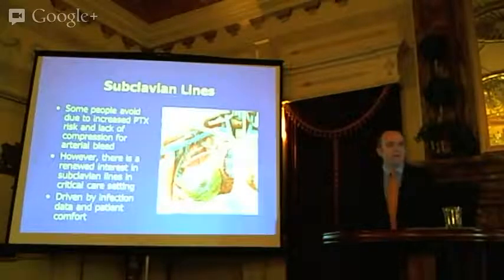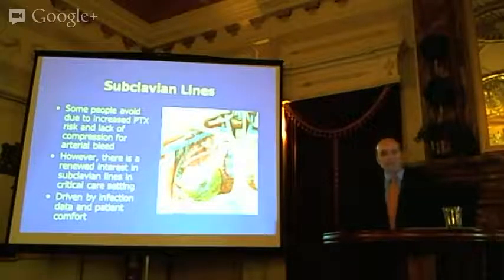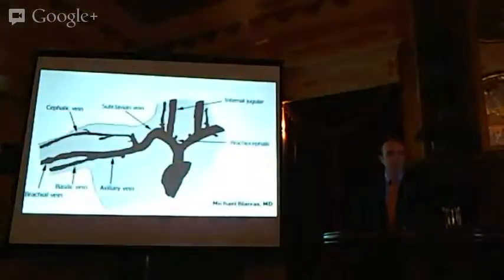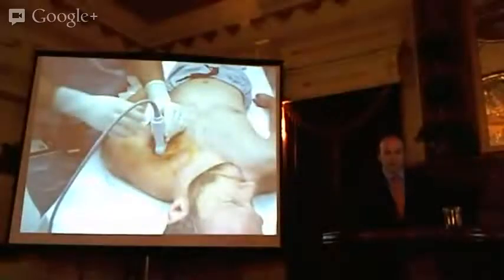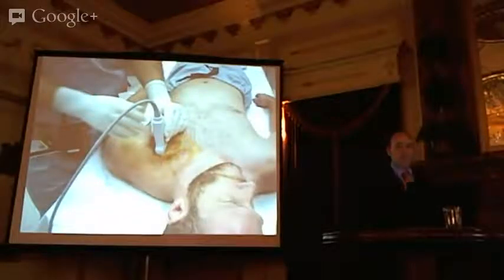Subclavian lines are also a great option. I think initially people think, subclavian, how are you going to get a transducer in that location? Well, remember, the axillary vein changes its name right about here to subclavian. It's the same vein. You can be a centimeter out from it. There's no real difference. You can still have your wire in the perfect location, and that's probably what you're really going to be doing with an axillary approach with ultrasound.